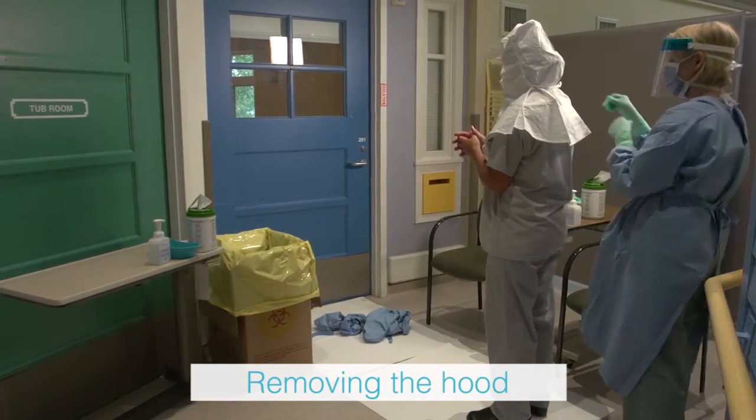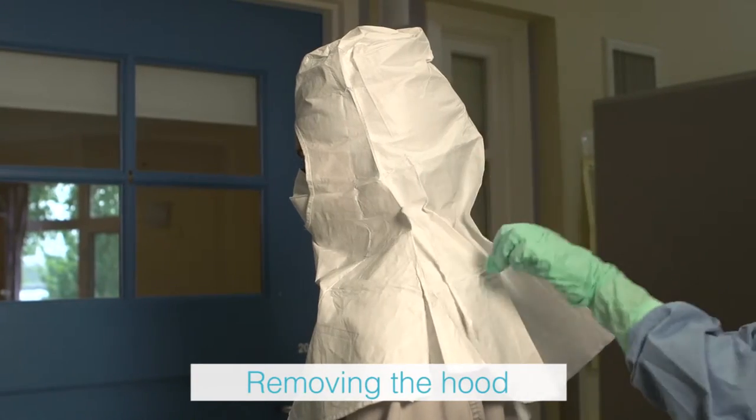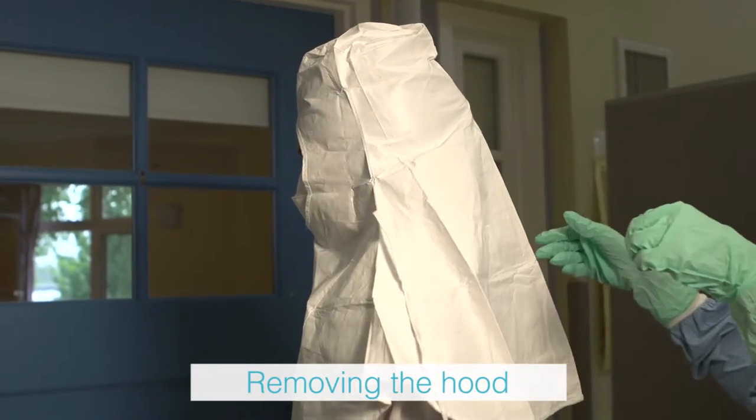The trained observer loosens the hood ties at the back and gently lifts the hood off the health care provider's head, placing it in the waste receptacle.